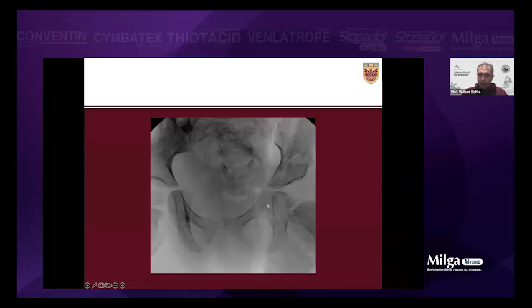So the same suture we did, the 3, I suture them tight. When I get to the edge of the capsule here, I try to slide it more medial. So don't try to slide things medial to lateral, because it won't, but slide things from lateral to medial. And this is what Dr. Salter initially mentioned as a capsular shift.